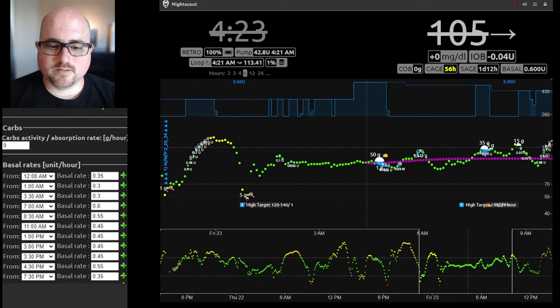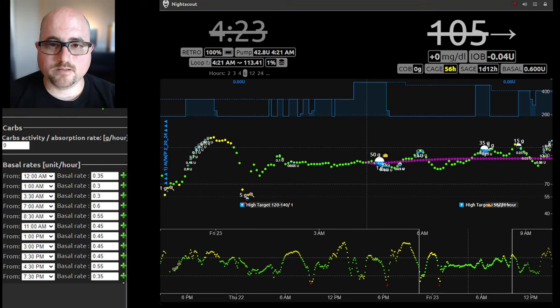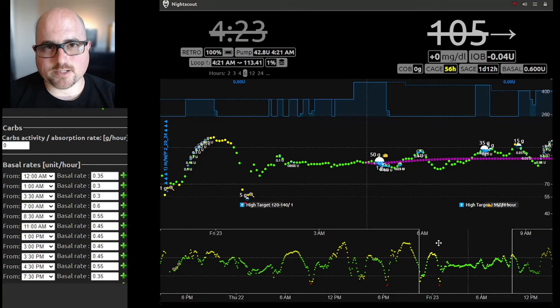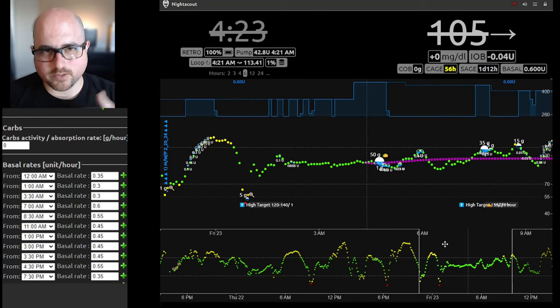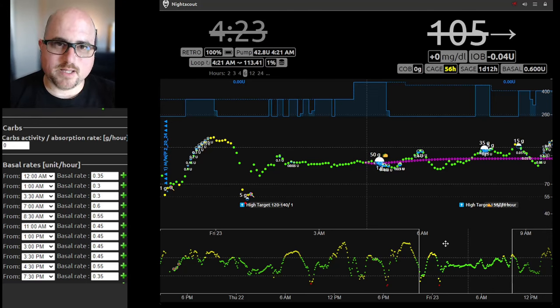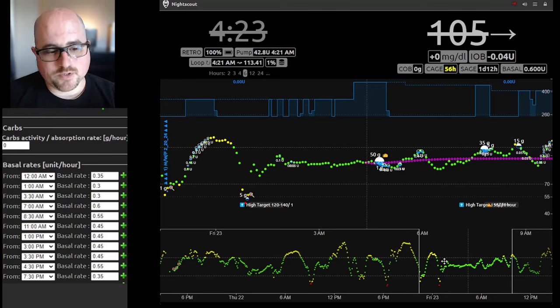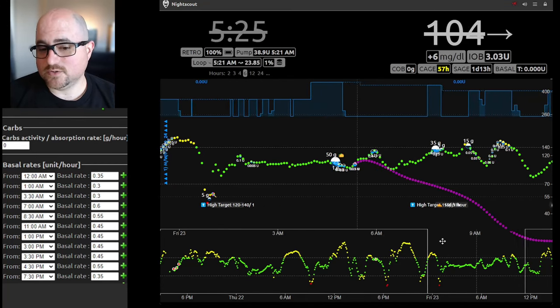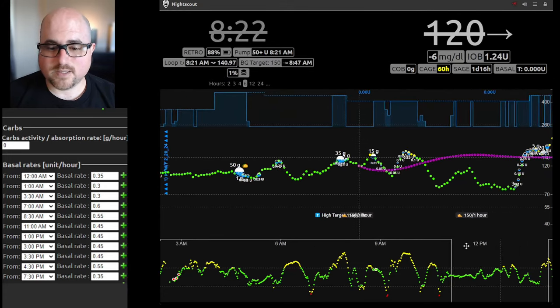It's mostly because of breakfast and because I'm trying to work through the settings — my nights are very different from my days. So for this morning, it actually looked fine. Usually what would happen if basal rates are pretty high is you'd see crashes one, two, three hours after a meal — you're catching lows a lot. So then you treat, shoot back up, and that starts the up-and-down process. It's hard to get away from a basal rate that might be double of what's working overnight — you usually see pretty significant crashes. So this morning that didn't happen, which is a little unusual. I would expect that, but I think it did catch up a little bit here.